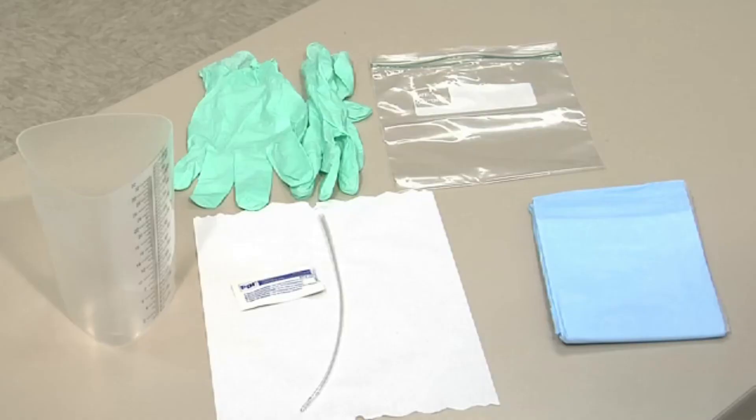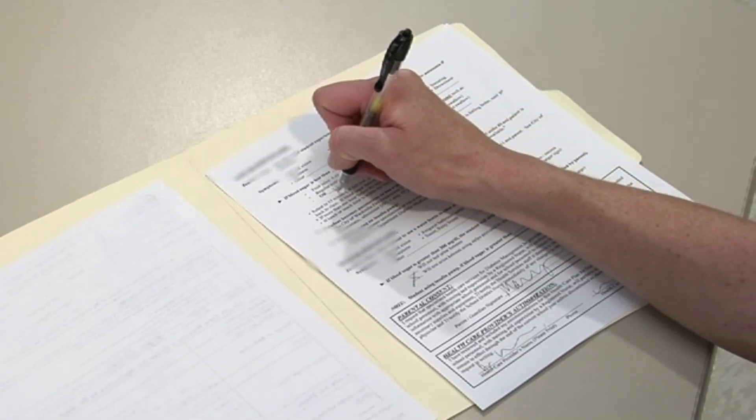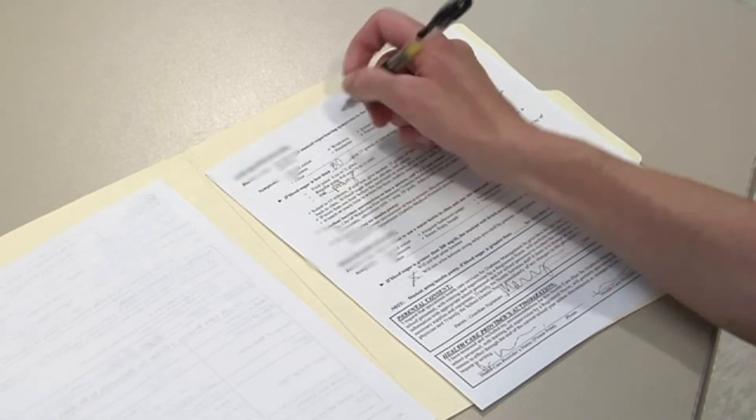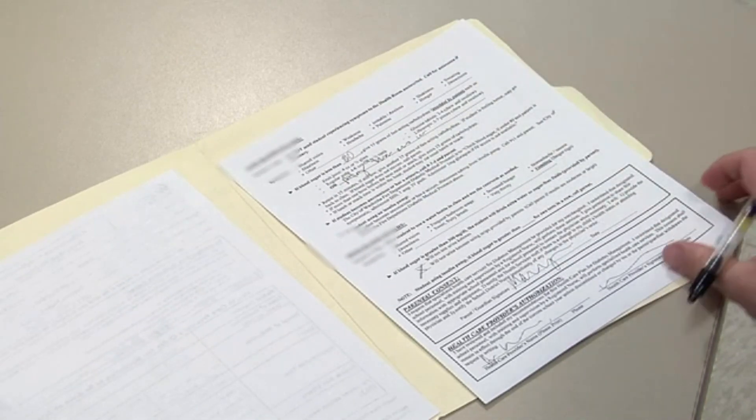If the student reuses the catheter, clean as instructed. Document the intervention and outcome in the student's healthcare record. Update the student's parent or guardian and healthcare provider as needed.